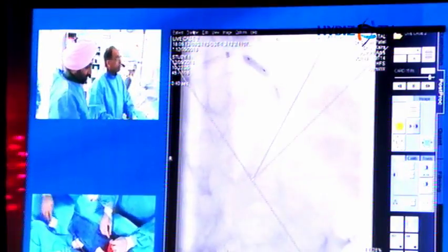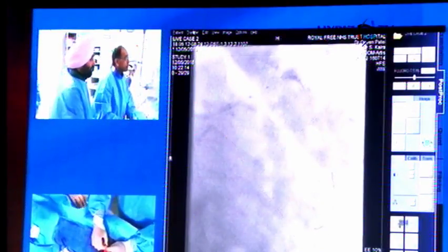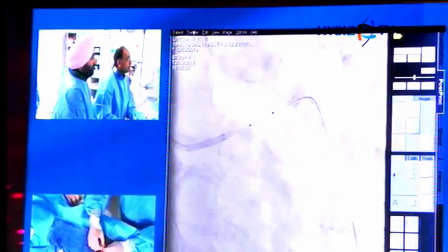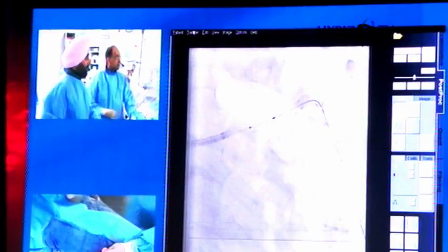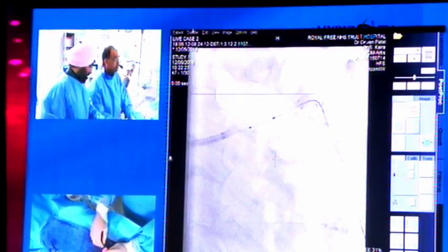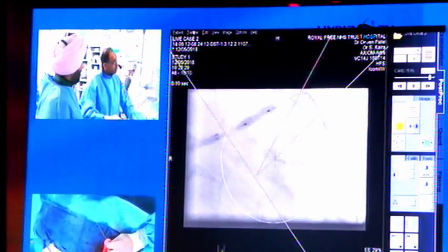22, and down. Can we come to the AP caudal, please, just to confirm we've covered the ostium? Stop there, thank you. Tower down, cone in, please, double mag. Okay, I'll use double mag here just to confirm the position. That's a very nice tool, and we often teach our fellows the exact same thing. Yeah, 20 bar, please. Okay, 20 bar there, okay. Down, please, thank you. Single mag, back to the cranial view. And we'll do the final OCT at this point.